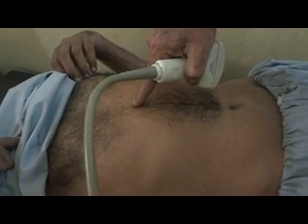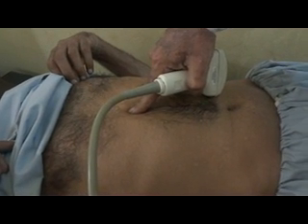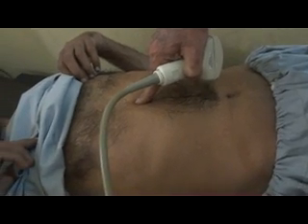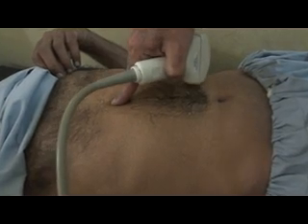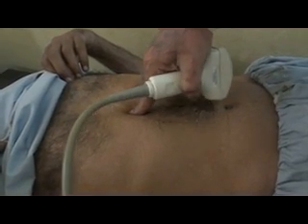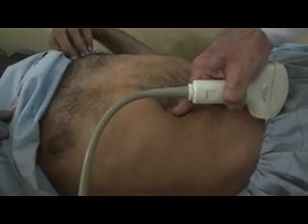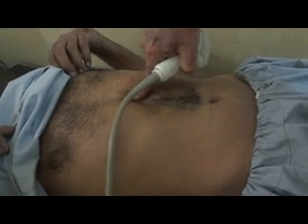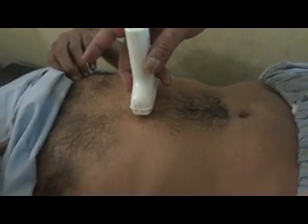You know, the pancreas is a retroperitoneal structure. So what you do is place the probe just below the xiphoid process and ask the patient to take a deep breath and hold it. This is method number one. If you get the pancreas in this way, fine enough. Otherwise, let's see first this on the screen.